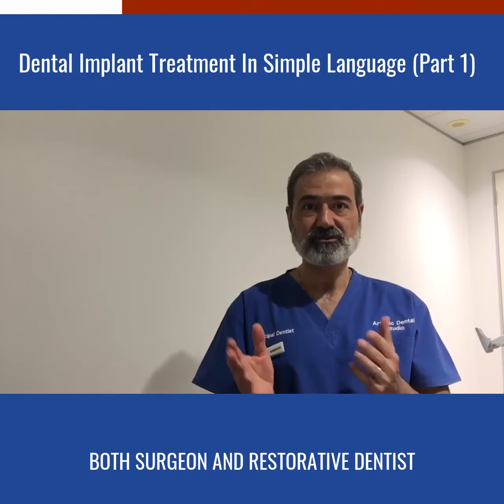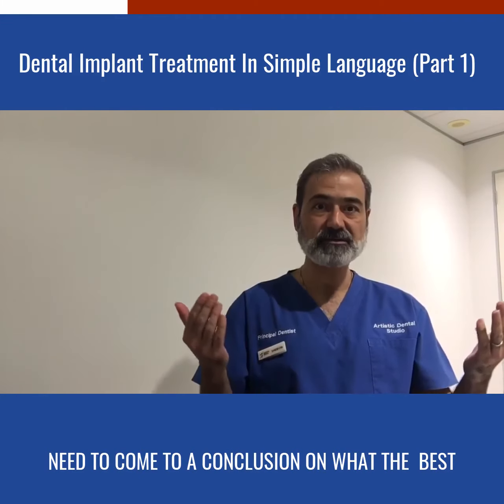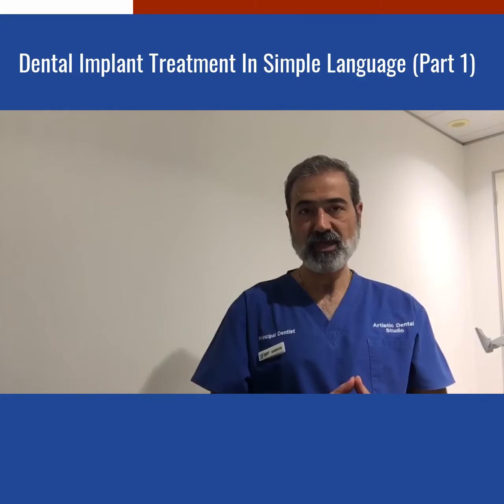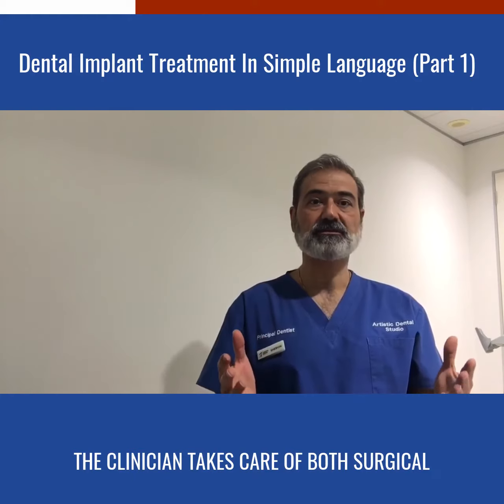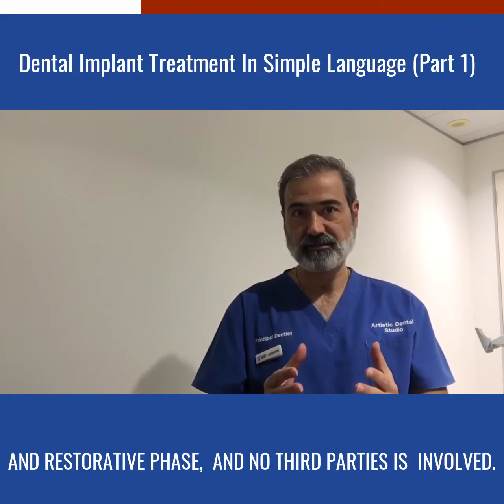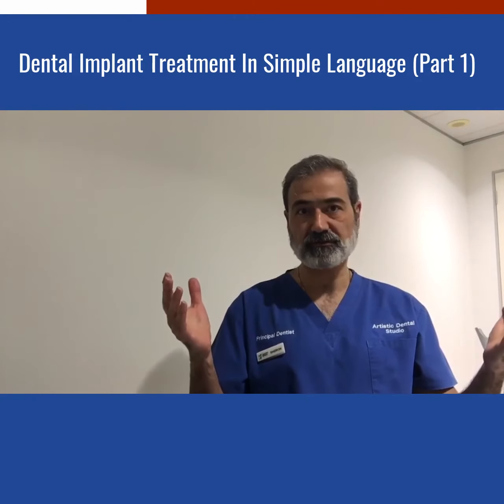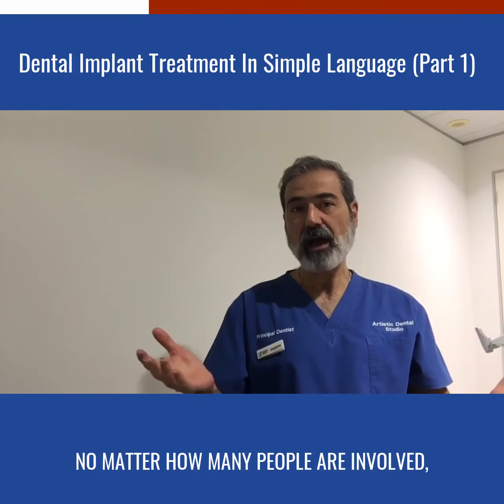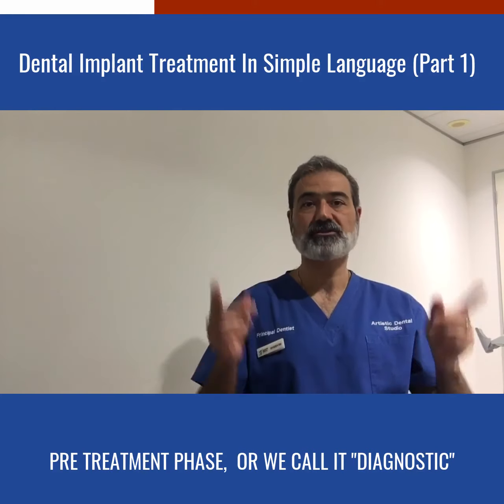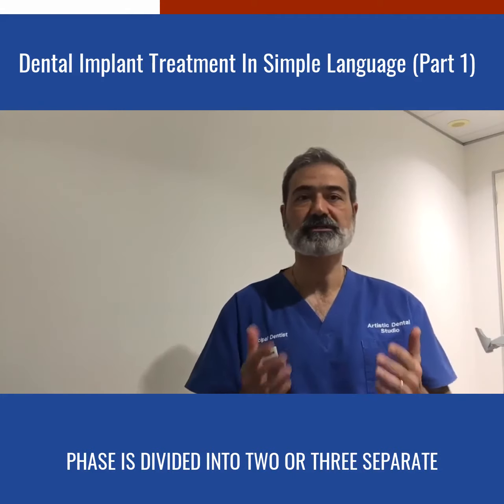Both surgeon and restorative dentist need to come to a conclusion on what the best solution could be for any individual case. In many cases, the clinician takes care of both surgical and restorative phase, and no third party is involved. No matter how many people are involved, pre-treatment phase, or we call it diagnostic phase, is divided into 2 or 3 separate appointments.